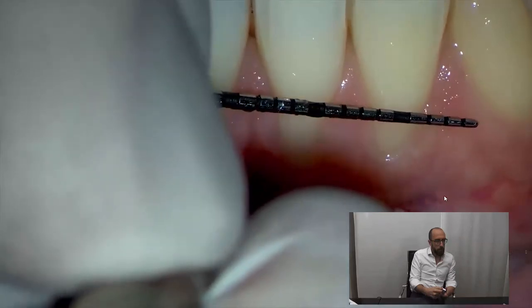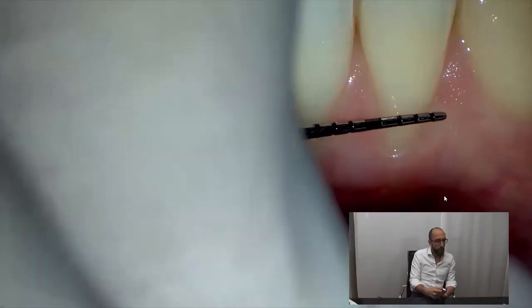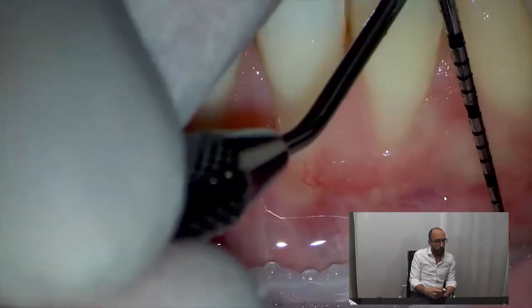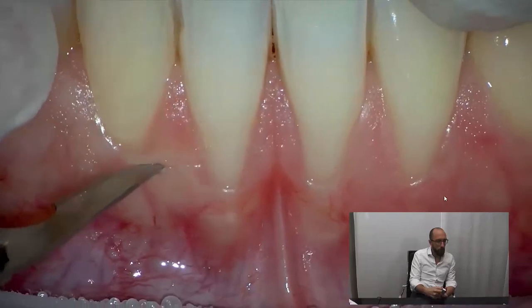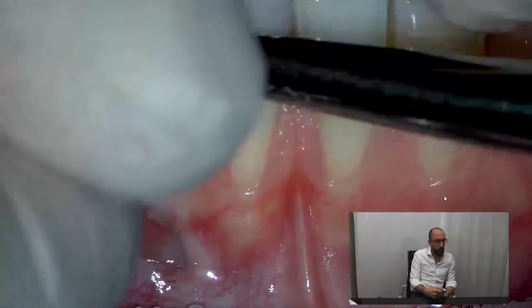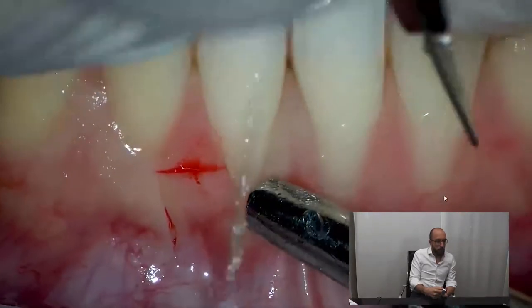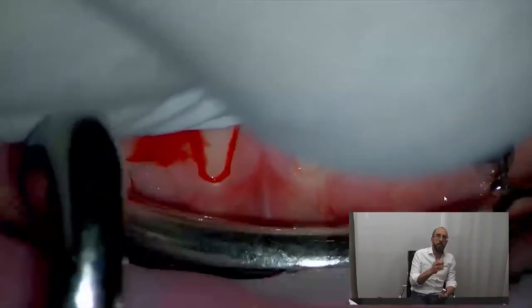The horizontal incision on one side and the other side, going five millimeters above the mucogingival line — very shallow incisions. Another difference in this anatomical zone is the bleeding, so while performing the surgery in the anterior mandible you have a lot of bleeding.